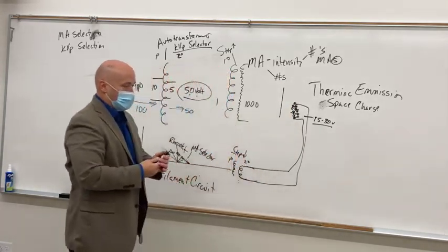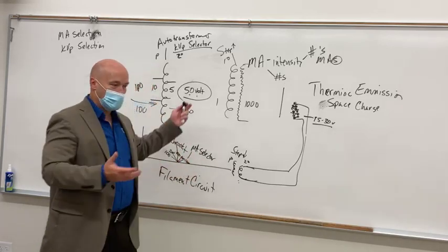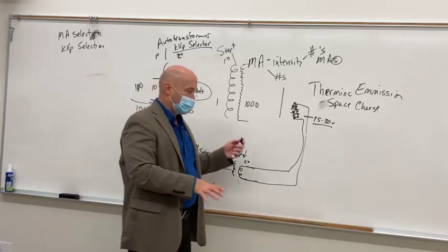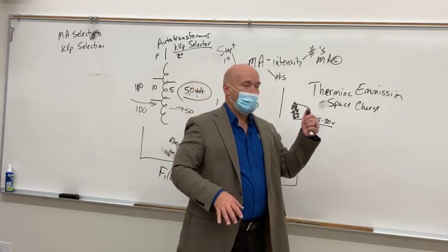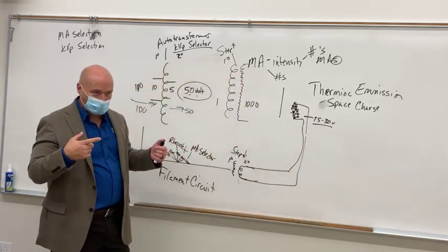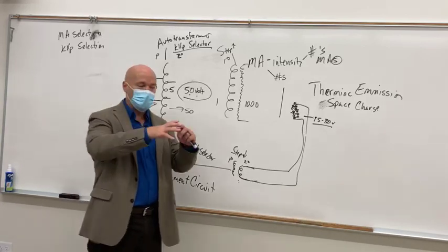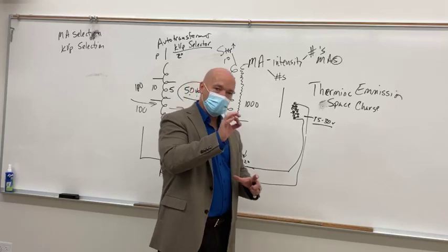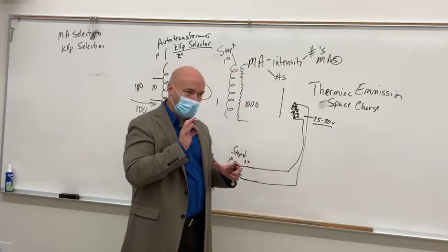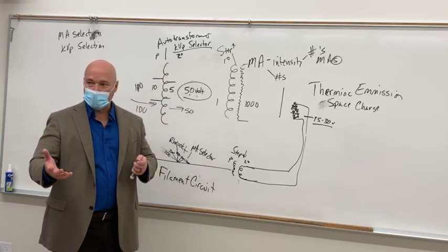So you walk into the room, you've positioned everything, you're doing a finger, you've got the patient squared away, you press the prep button, and what you get is rotation of the anode. The rotation of the anode is for protection of the X-ray tube. It spreads out the heat instead of concentrating it in just a little bitty area, so that it extends tube life.